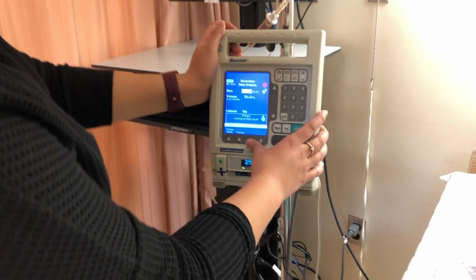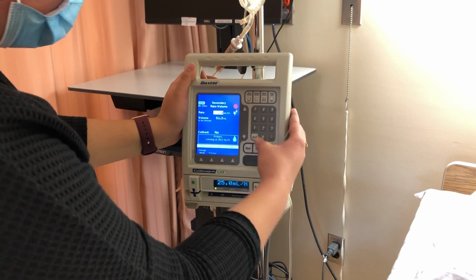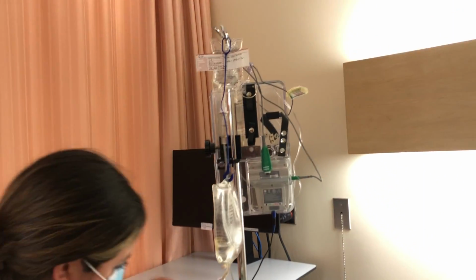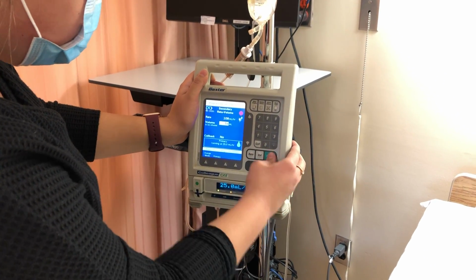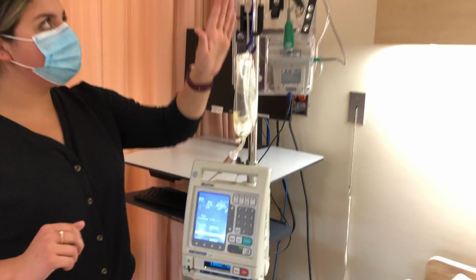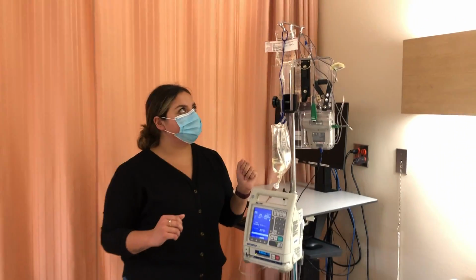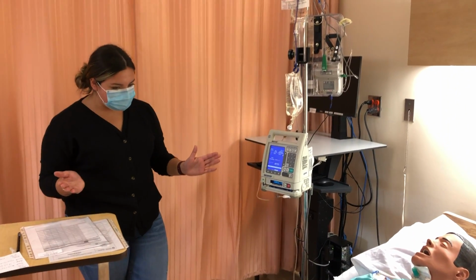So secondary, I've already calculated that my rate is 108 milliliters an hour. So we got 108. My final volume is 54 milliliters. 54 milliliters. Confirm secondary. Start. So now my secondary line is running. I'm ensuring that I can see 3 drops running in the chamber on my secondary. My patient is not experiencing any distress.